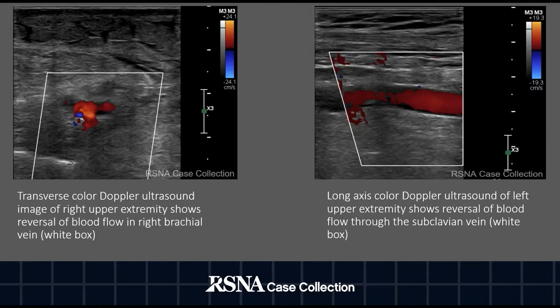On the left, you can see a transverse color Doppler ultrasound image of the right upper extremity, which shows reversal of blood flow in the right brachial vein. On the right, we have a long axis color Doppler ultrasound of the left upper extremity, which shows reversal of blood flow through the subclavian vein.